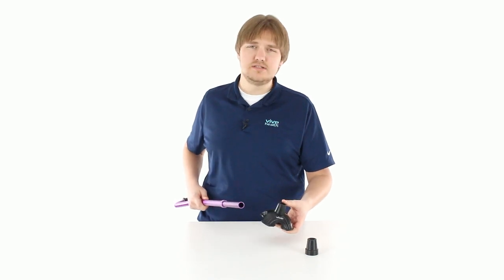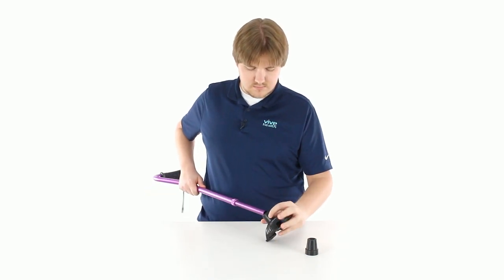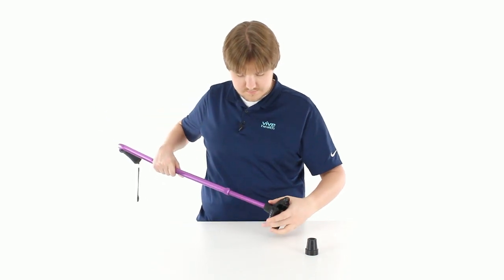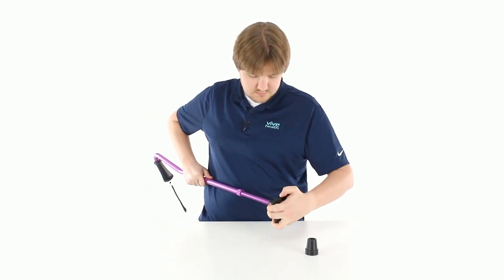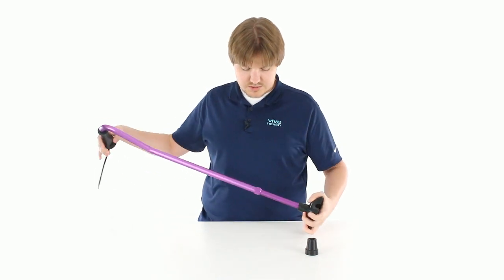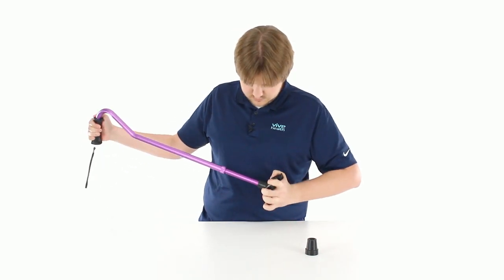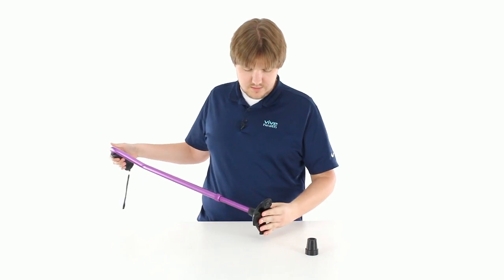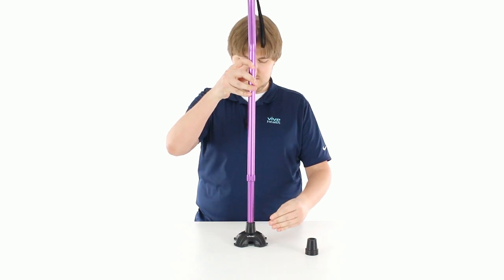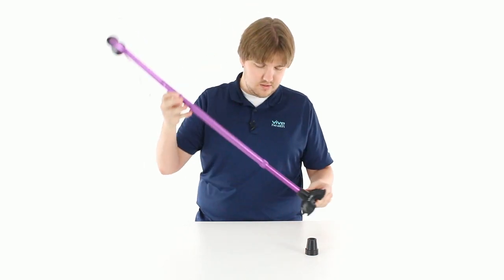The Quad Cane Base goes on the same way. Just get that there, make sure that's lined up. Once it's in there, just kind of work it back and forth to get it attached. Make sure it's squared up. It's as easy as that — the quad cane will even stand up on its own like so.